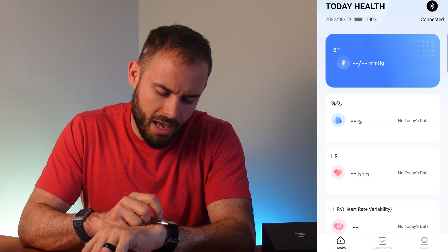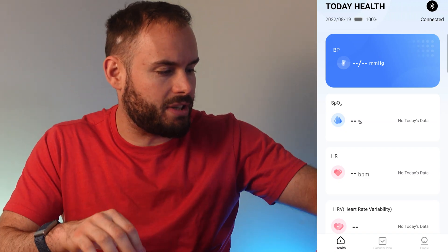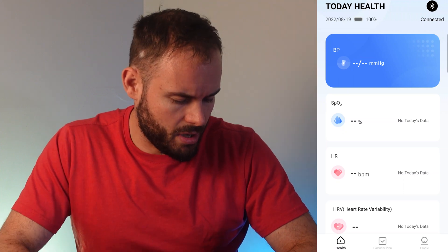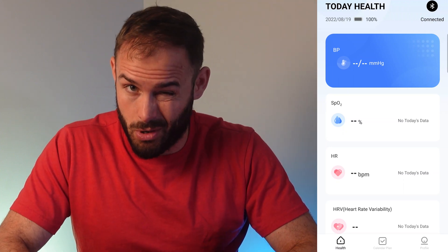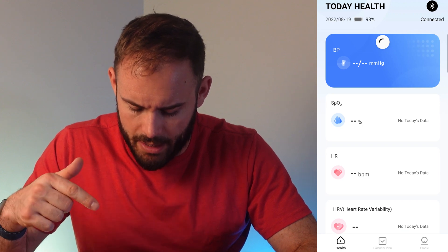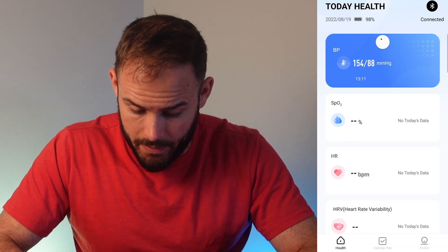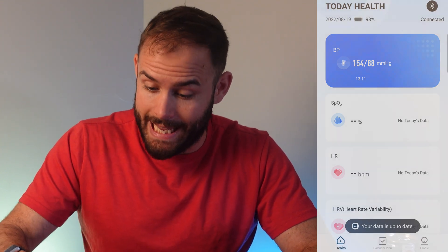Let's go ahead and hit start on blood pressure. It says to keep it at the same level as your heart, and usually you should stay quiet. It gave me a reading — let me refresh the app to see it. It shows 154 over 88.